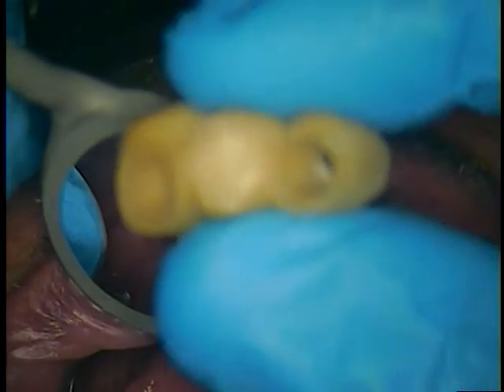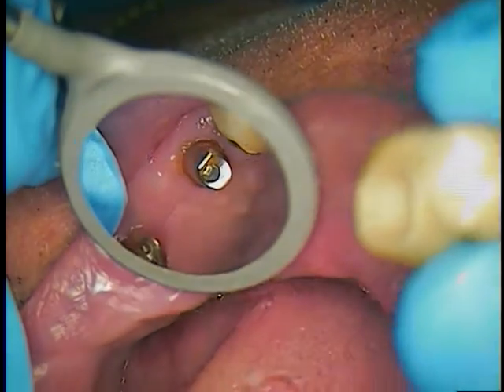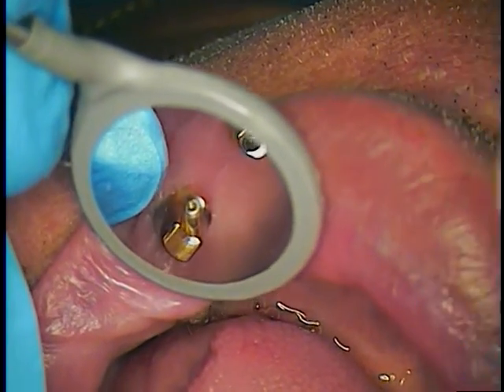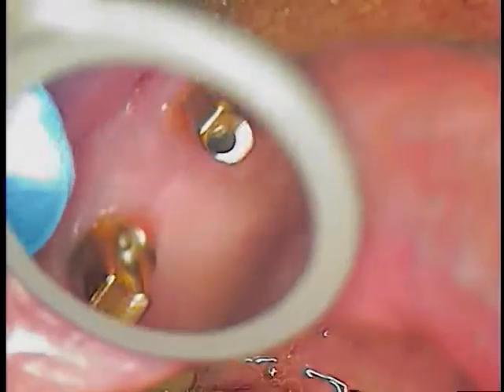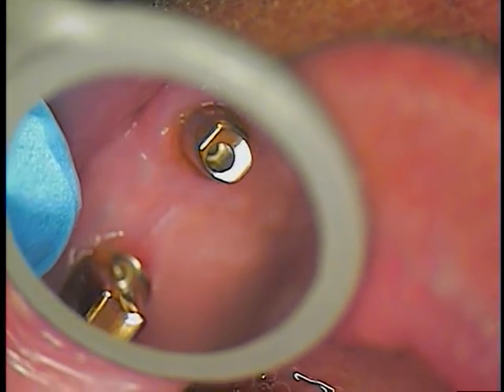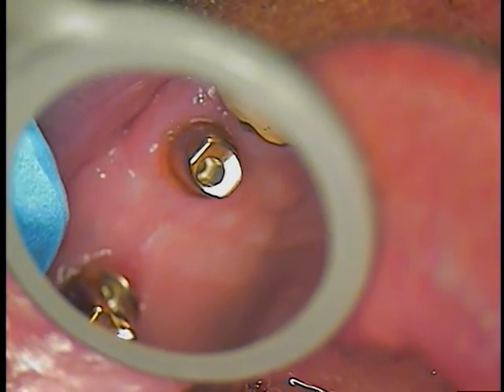So do it in two pieces just like that — no problem. You've got one more short visit, but it makes all the difference in the world. Going in permanently next time. Dr. Jerry Cuomo, hope you liked this video. We'll see you back at the next step, which will be the final screw-retained case for ankylosed implants.